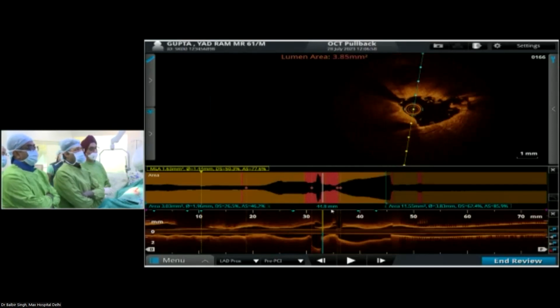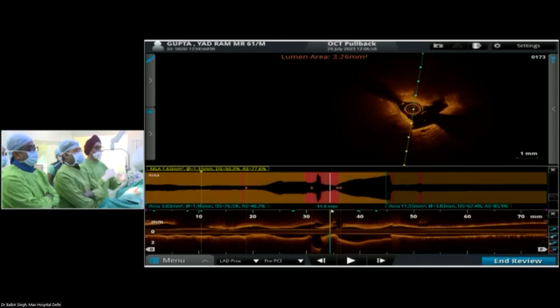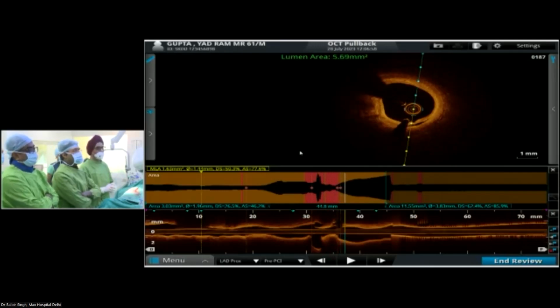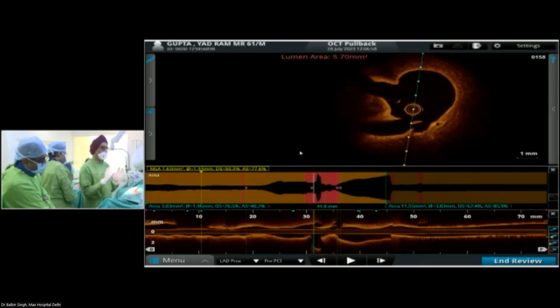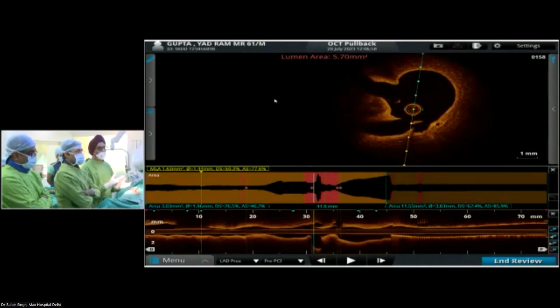And we have already created a dissection in the nodule. So you can clearly see the nodule on one side. The dissection is coming from upwards, downwards, telling you that you created more pressure there. So there's clear dissection with the nodule, right? Okay, plaques are correct. So the first lesson from here is that left main bifurcation is better evaluated by OCT. Second, calcified nodule is better seen. Third, a dissection can be so clearly seen on OCT and not so well seen on IVUS. Three glaring differences which I have shown you in this.